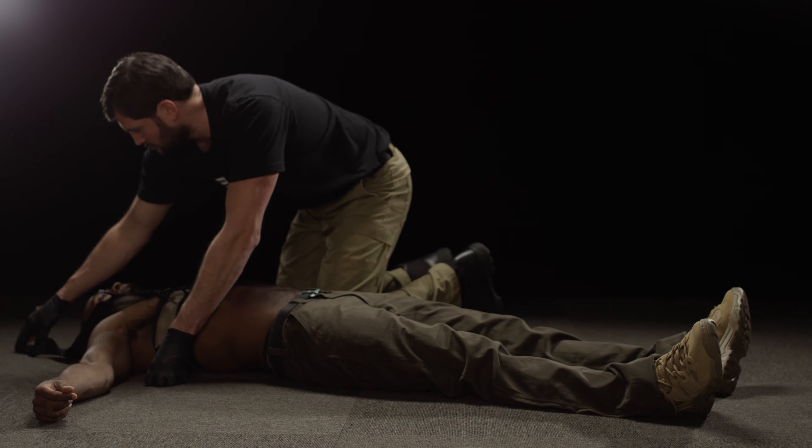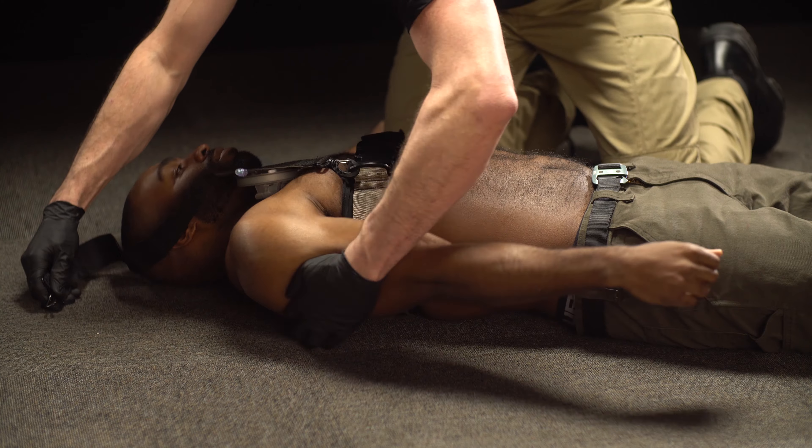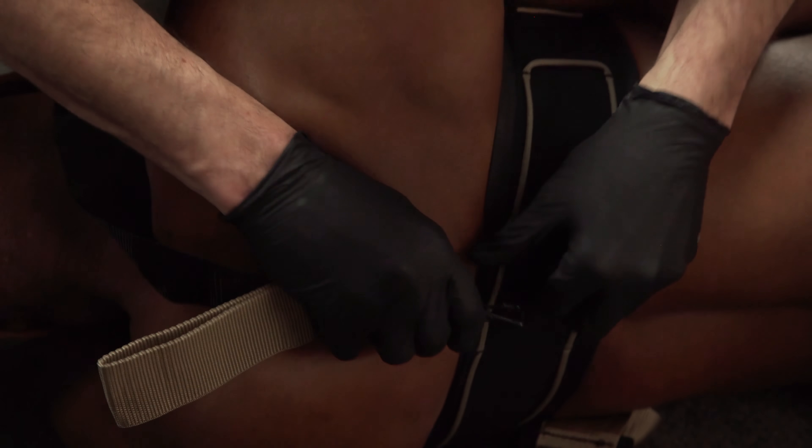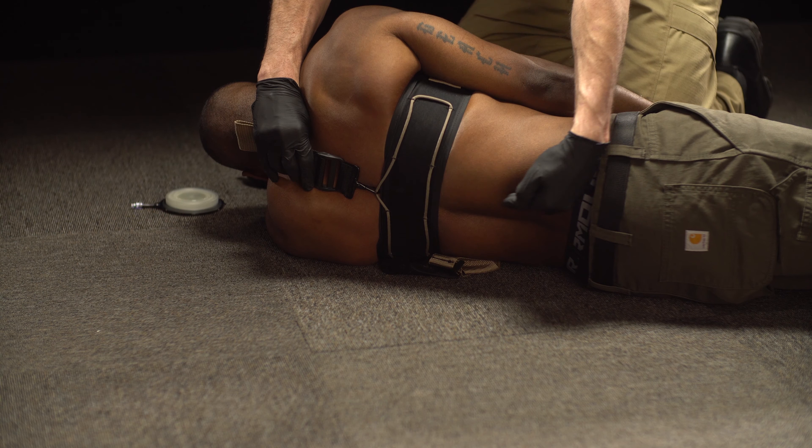Then place the auxiliary strap over the patient's shoulder, positioning the Velcro toward the patient. Reach behind your patient and attach the metal clip to the paracord on the back of the belt, as close as possible to your patient's midline. Ensure that the paracord is fully seated within the snap hook and not the body of the belt or your patient's clothing.